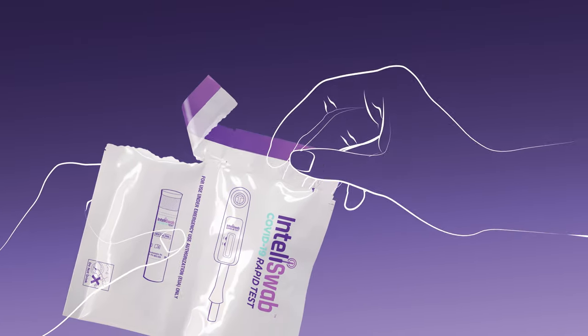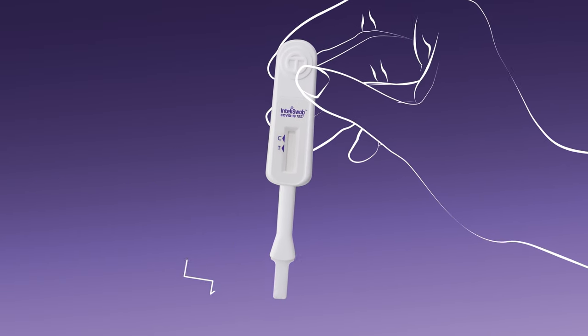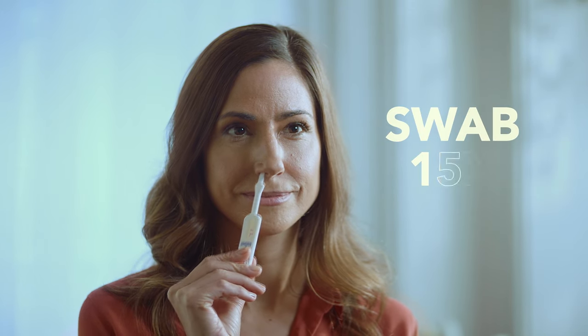Remove the test device from the foil pouch and be sure not to touch the flat swab tip with your fingers. Insert the tip of the flat swab inside your nostril. Circle around the nostril 15 times and maintain contact with the inside wall of the nostril. Do the same with your other nostril, circling the swab around 15 times.